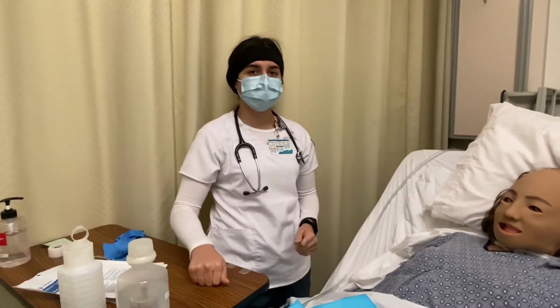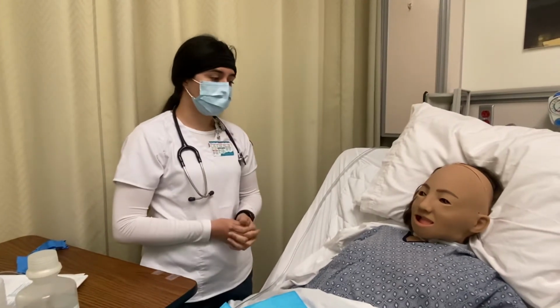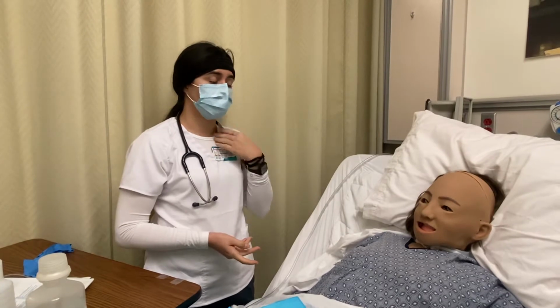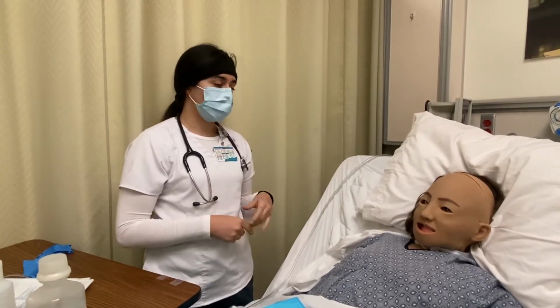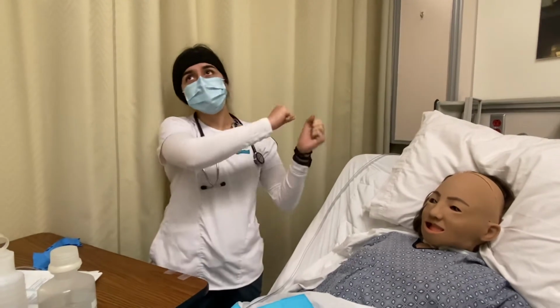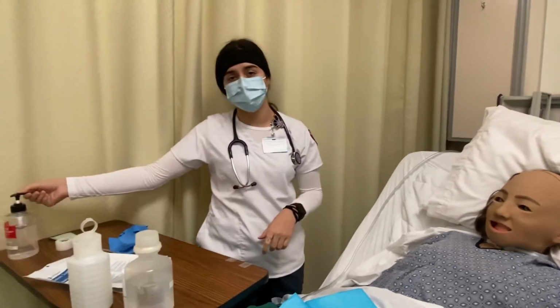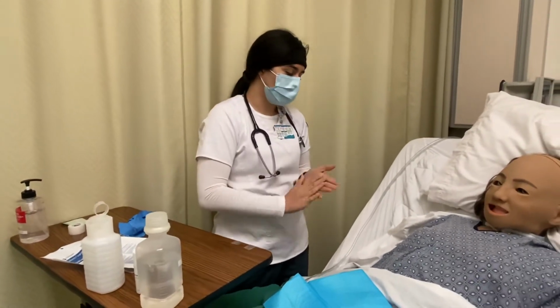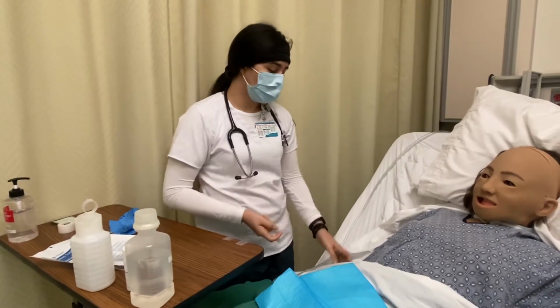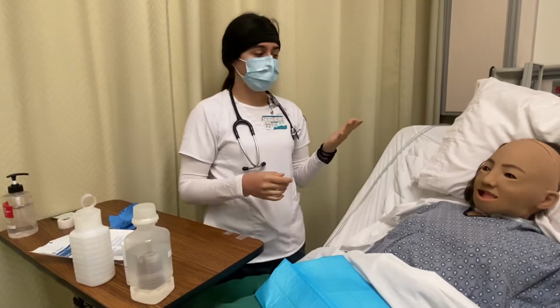I'm going to say, hi, my name's Ingrid, I'm going to be your nurse today. The doctor ordered an NG tube insertion, so what we're going to do is put a tube inside your body. Then I would provide privacy by closing the curtains, and do hand hygiene as well. Then I would tell the patient to state their first and last name and their date of birth, and make sure it matches their wrist band and also the chart.